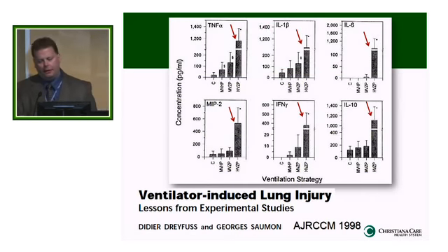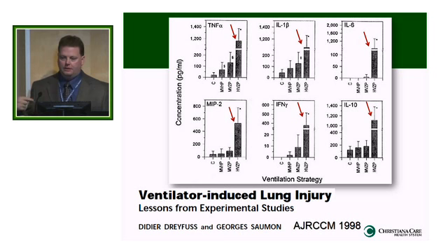Very quickly, this placard just shows that, again, back in 1998, we were well aware of ventilator-induced lung injury, and this is an animal experiment where they used PEEP or no PEEP in a sense. I'm going to point out to you when they didn't use PEEP, and this is sort of wrapping that injury concept into why do we care about recruitment, because you're going to hear about PEEP and some other things when it comes to recruitment.